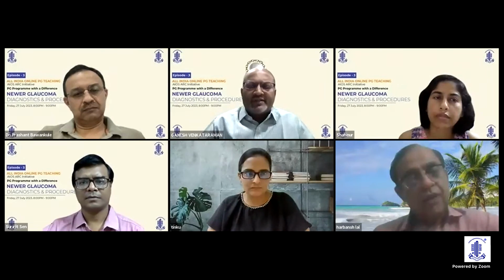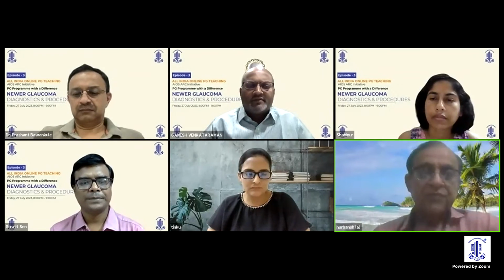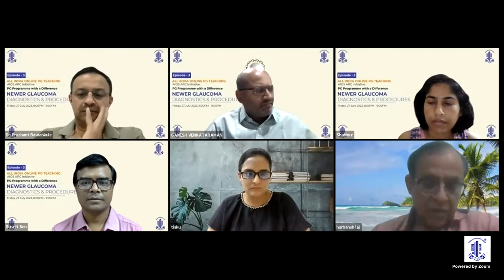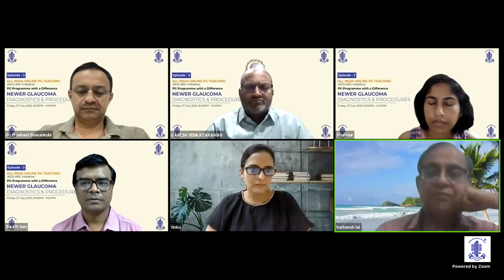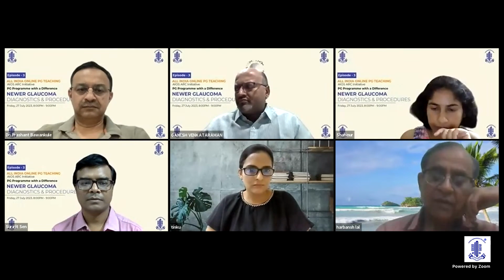Dr. Surijit, you want to take that? Can I answer, sir, for this? Yeah. In fact, with micropulse, they say the inflammation is very less because of the cold, these things, the reaction and the inflammation is less. So that way it is beneficial when compared to TSCPC.